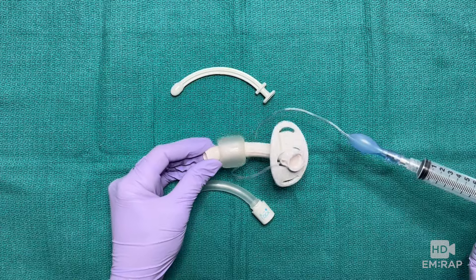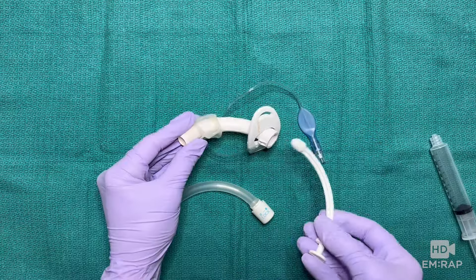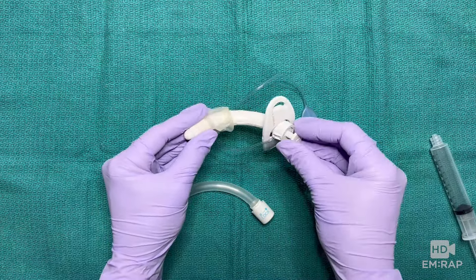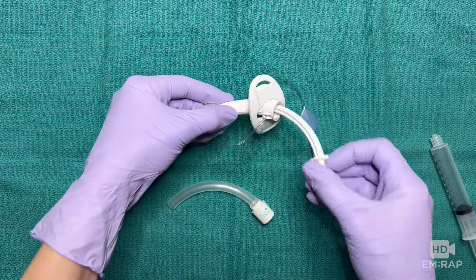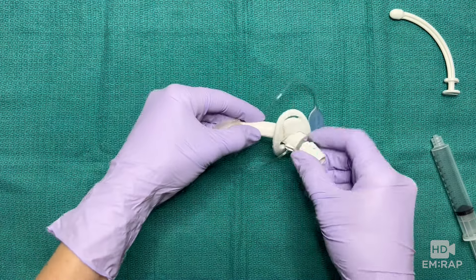Check the balloon to make sure it doesn't have a leak, then fully deflate it before insertion. Slide the obturator into the outer cannula for placement. Once properly placed, remove the obturator and insert the inner cannula, which clicks into place.